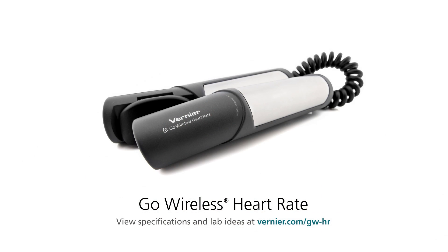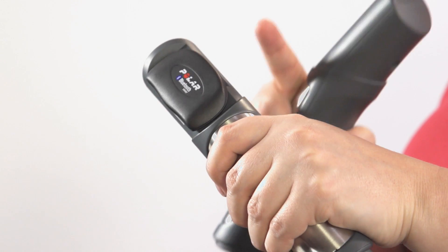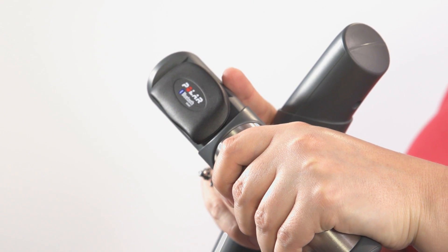Today I'm going to talk about the Vernier Go Wireless Heart Rate. When you order the Go Wireless Heart Rate, you'll get a pair of hand grips along with a Polar Bluetooth module.